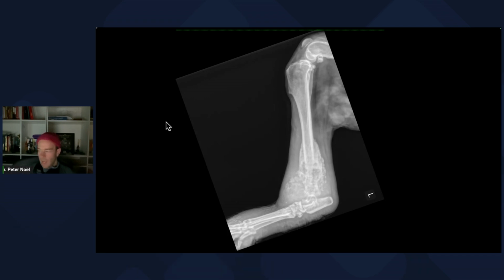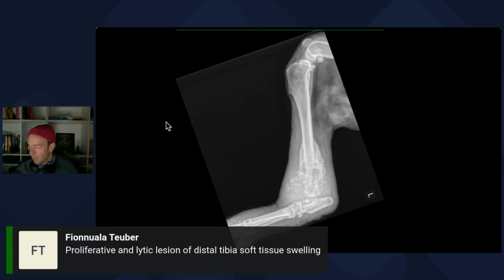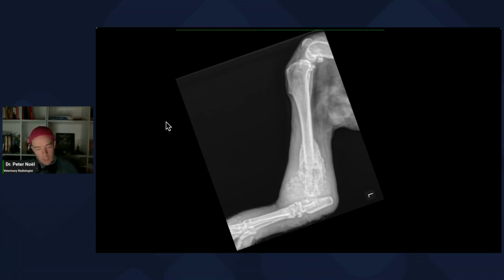Nice. Yeah. So here's how I would approach this one. First thing you do is you say the location. So it's distal left tibia, but the real severity of disease you could imagine is sort of in here. But if you're not sure, it's definitely different than mid-diaphysis, right? So in the distal metaphysis, this is how I would describe it. In the distal metaphysis, there's an aggressive bone lesion. The aggressiveness is characterized by medullary and cortical lysis, as well as spiculated/irregular periosteal reaction. The zone of transition is indistinct.